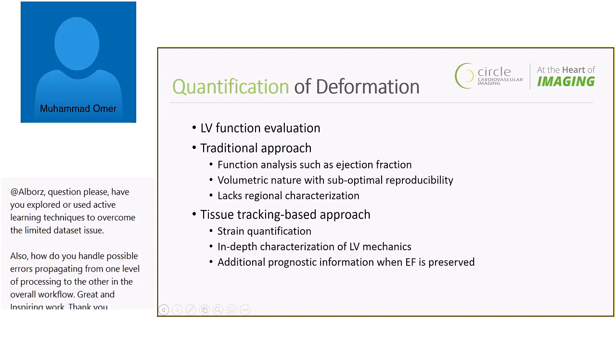This includes the strain quantification methods, which allow in-depth characterization of left ventricular mechanics. And this allows us to gain additional prognostic information in the cases when the global metric, ejection fraction, is preserved.